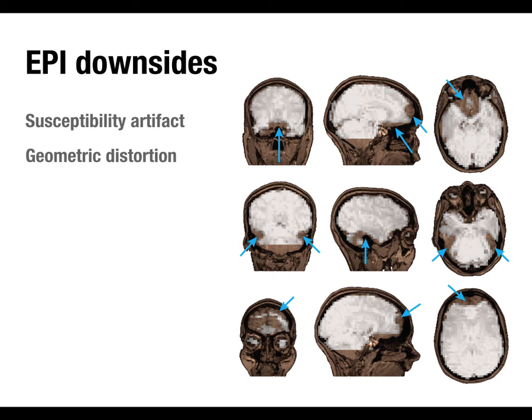When you're setting up your scan, you can actually tilt your slices so they're not necessarily straight horizontal slices. And so if you have some idea of sort of where the pockets of air are, like you want to avoid the sinuses, you can actually tilt your slices in such a way that they actually sort of line up with that boundary better, rather than slicing through it. They're sort of parallel to it, and that can help with the image quality as well. I'm not sure what the best current practice is for hippocampus.